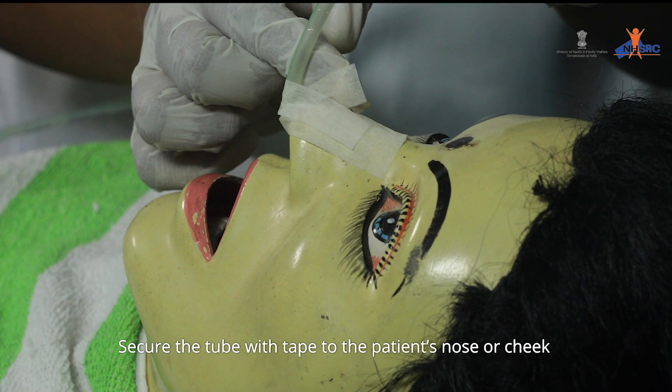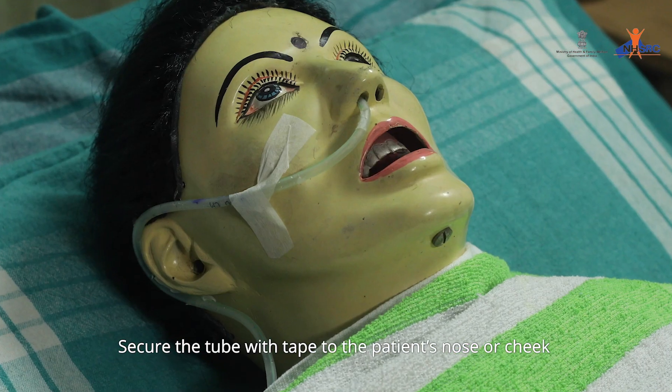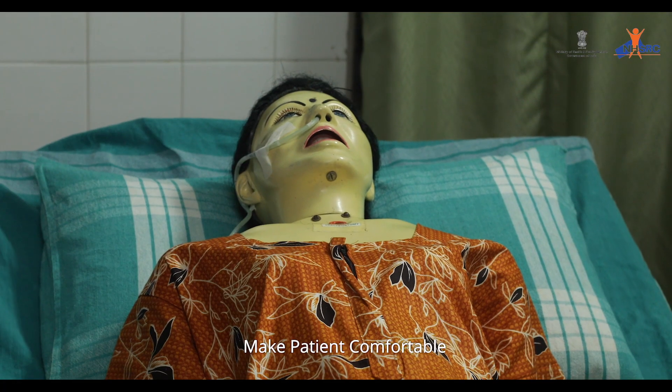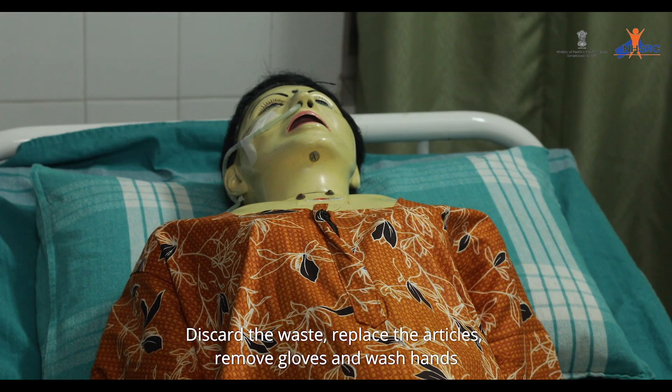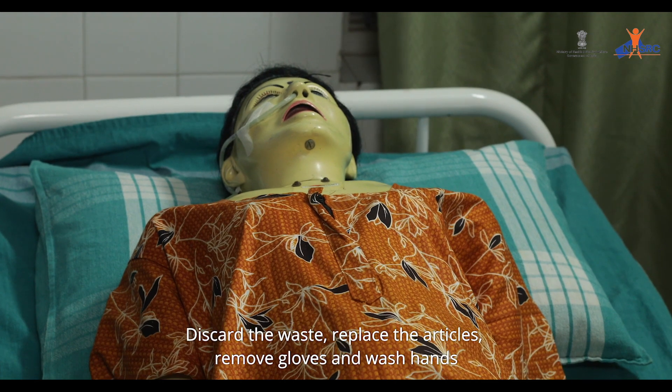Secure the tube with tape to the patient's nose or cheek. Make the patient comfortable. Discard the waste, replace the articles, remove gloves, and wash hands.